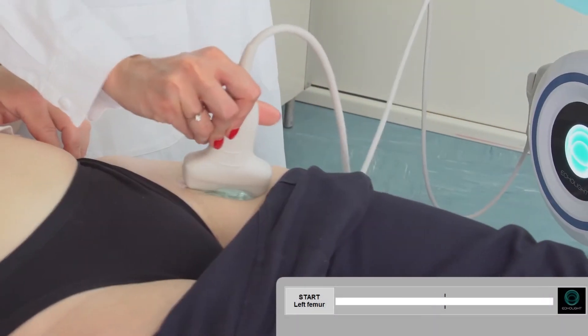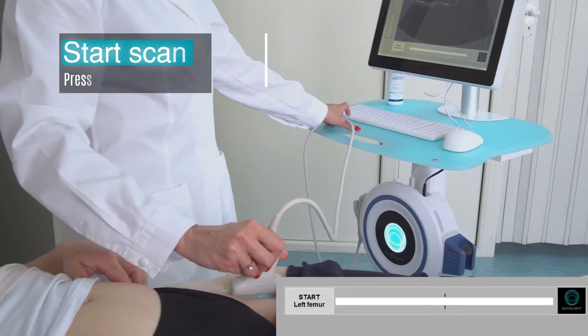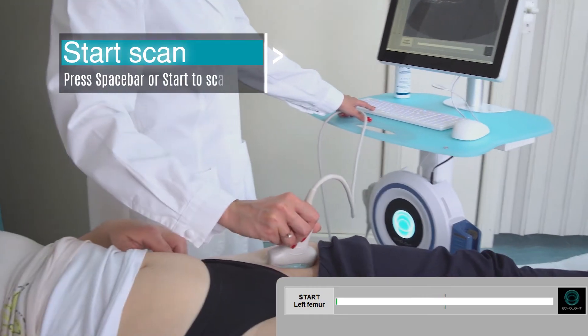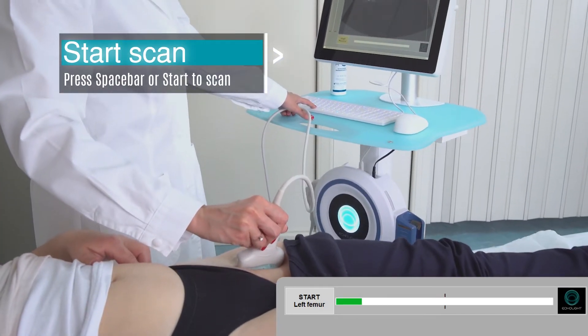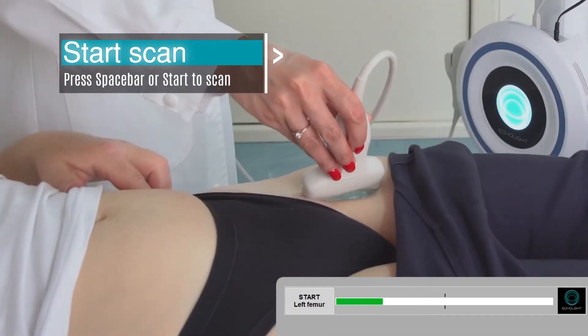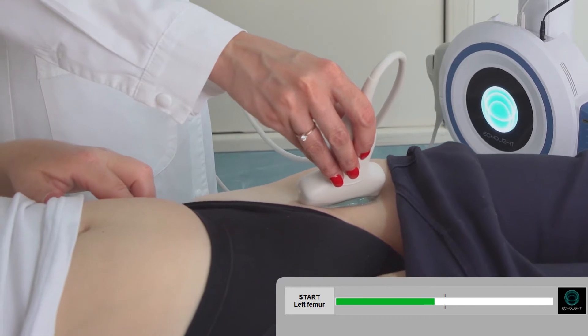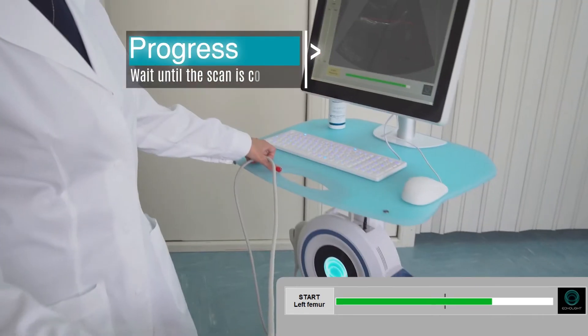To start the scan, press the space bar on the keyboard or start via the ECOS Studio interface. The green bar displays the scan progress and it will be complete in about 40 seconds.